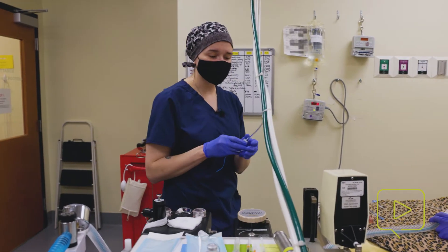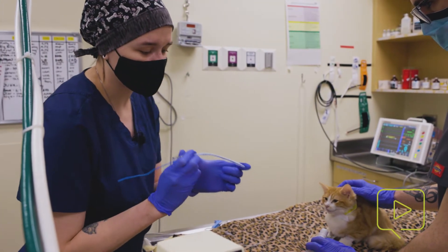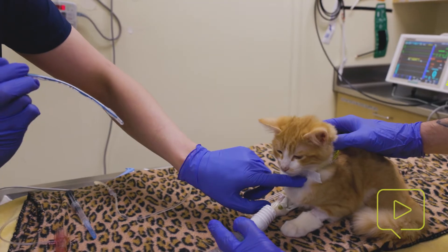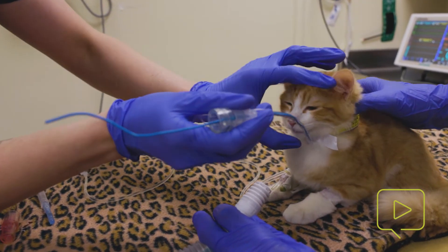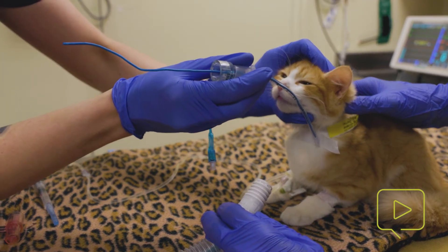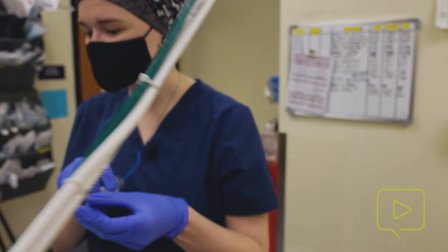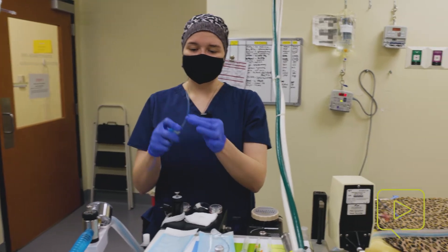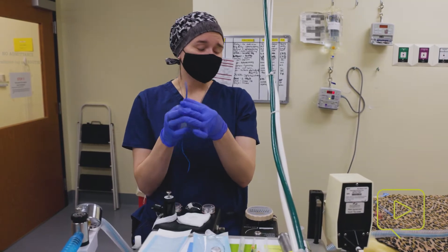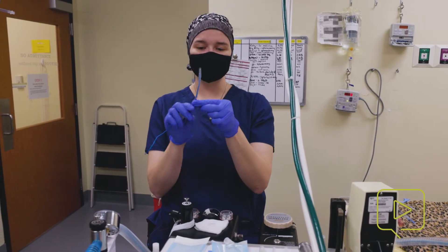We are going to size our ET tube and there are a couple of different ways to do this. We want to know the length of the ET tube so we're not over-intubating. The best way to do that is to find the point of the shoulder or the thoracic inlet — that's where the end of your ET tube goes. With mild extension, you want to go to about the tip of their nose or their canines. On this guy, we're probably going to be about 11 centimeters. The best way to confirm the size of the ET tube is to palpate the trachea itself and get an idea of how large it is that way.